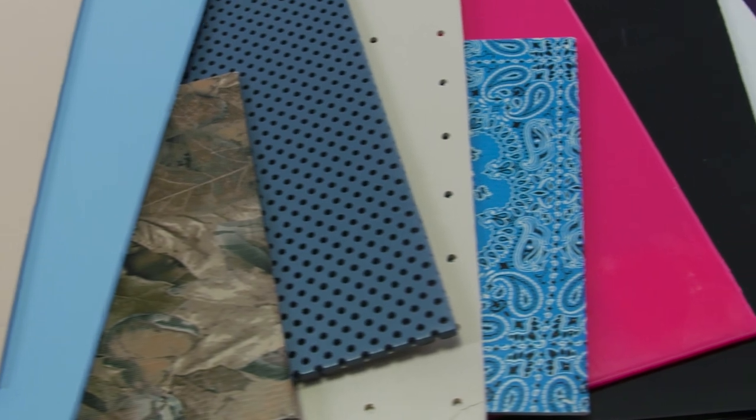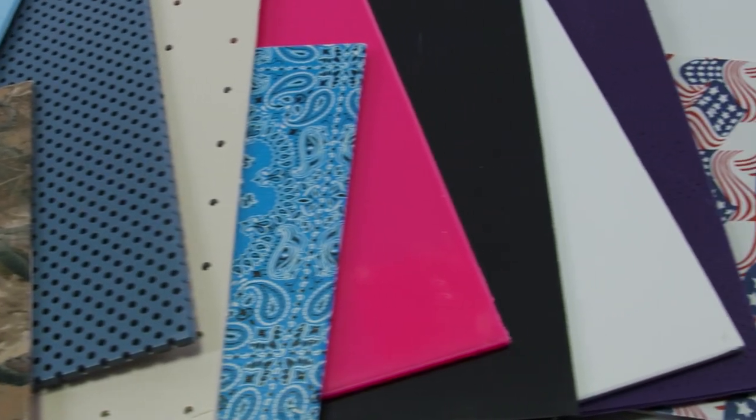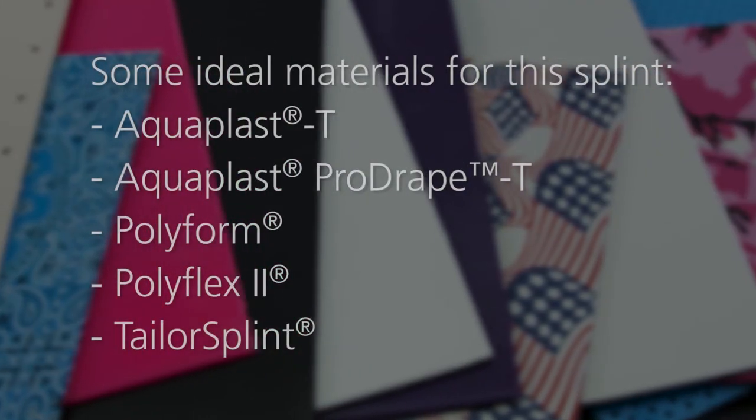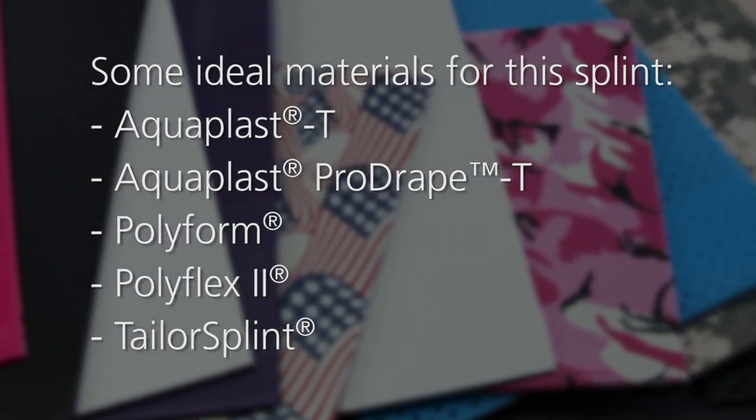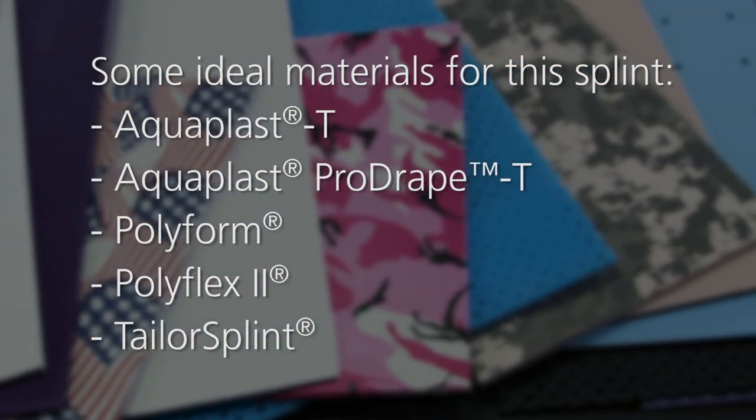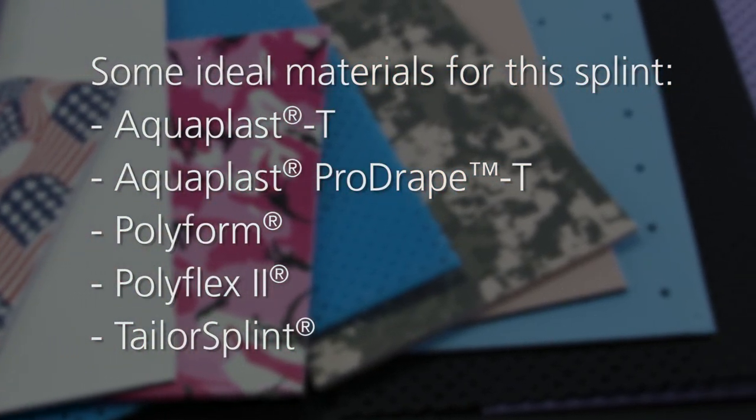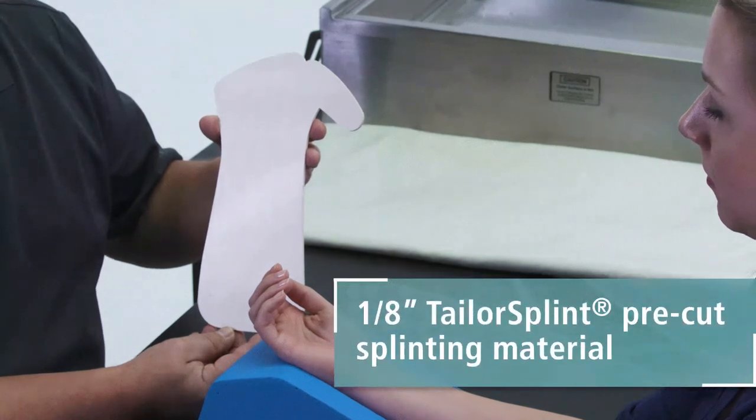Rolyan has a material for every splint, every therapist, and every experience level. A material with a high degree of conformability and low resistance to stretch are best for this splint. Today we will be using 1/8 inch TailorSplint pre-cut splinting material.